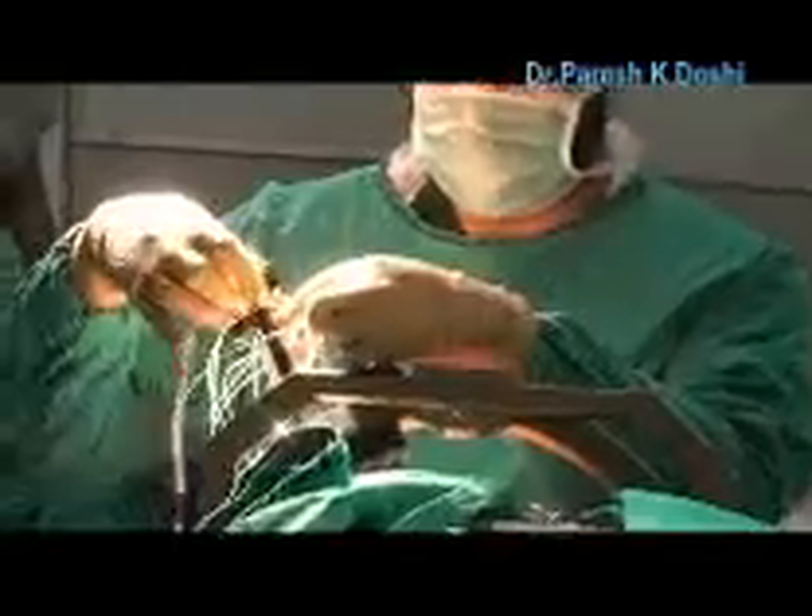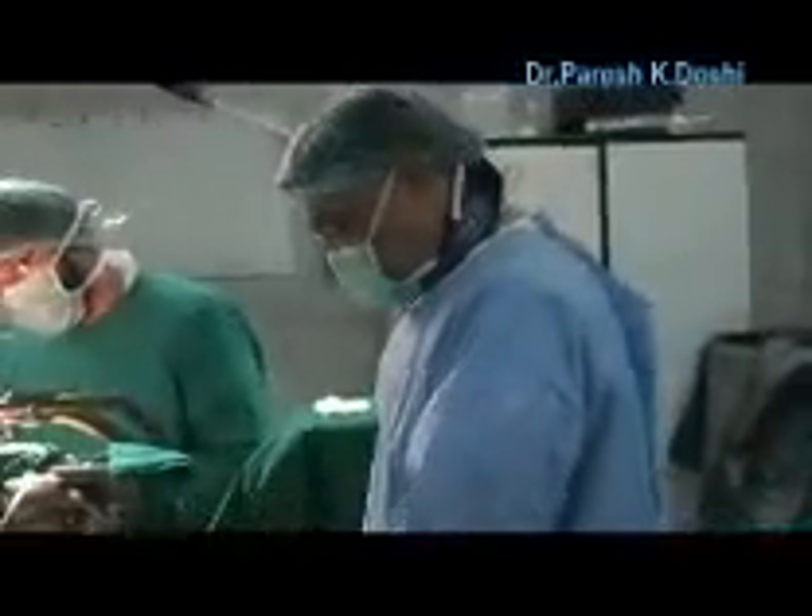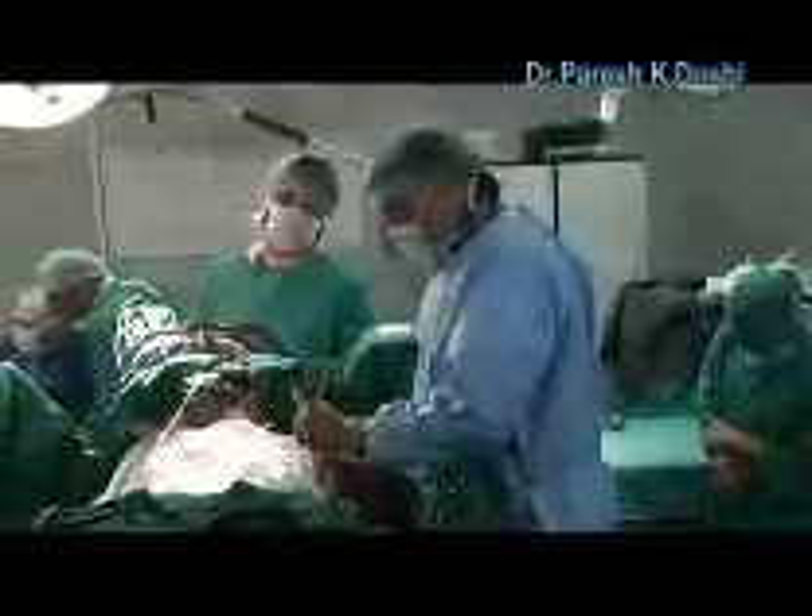Okay, central lateral. Ready? Skinner, Vishal. Rotate, rotate. Okay.